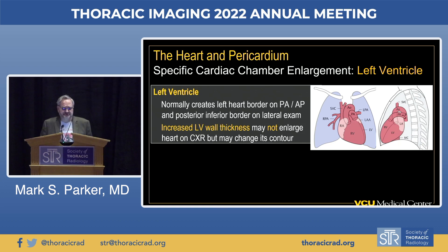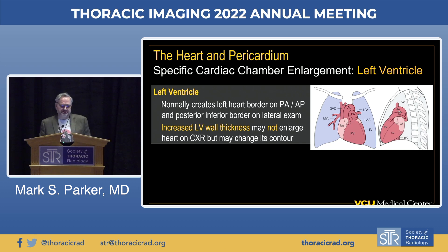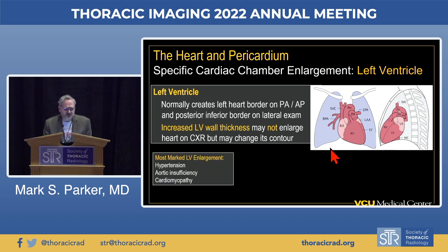Let's look at some specific chambers that enlarge—what they look like and why they enlarge. Beginning with the left ventricle: it creates the left heart border on frontal radiographs and is located posteriorly and inferiorly on lateral radiographs. The myocardium can hypertrophy quite a bit without actually enlarging on the chest X-ray, but you may notice changes in contour morphology. We most often see marked enlargement in the setting of hypertension, aortic insufficiency, and cardiomyopathies.